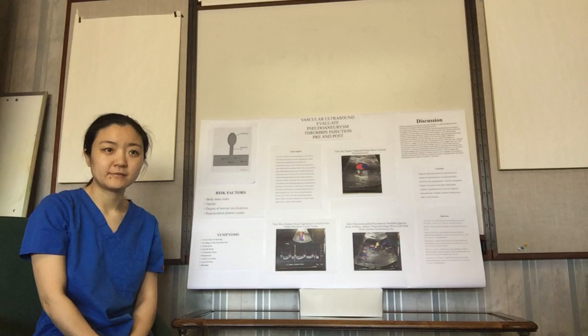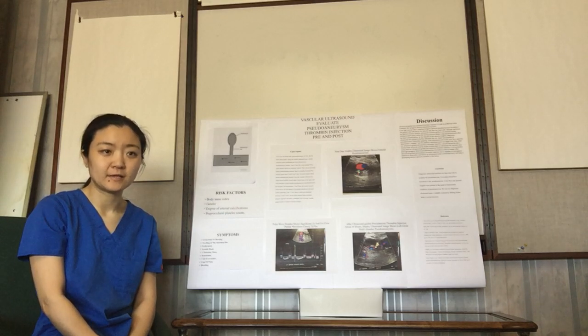extravascular cavity exhibiting flow and communication to the femoral arteries through a connecting path, with a characteristic to-and-fro Doppler pulse wave signal. After heart cath, if a patient gets a pseudoaneurysm, ultrasound-guided thrombin injection is a safe and effective initial treatment, especially as it has a high success rate treating lower extremity pseudoaneurysm.